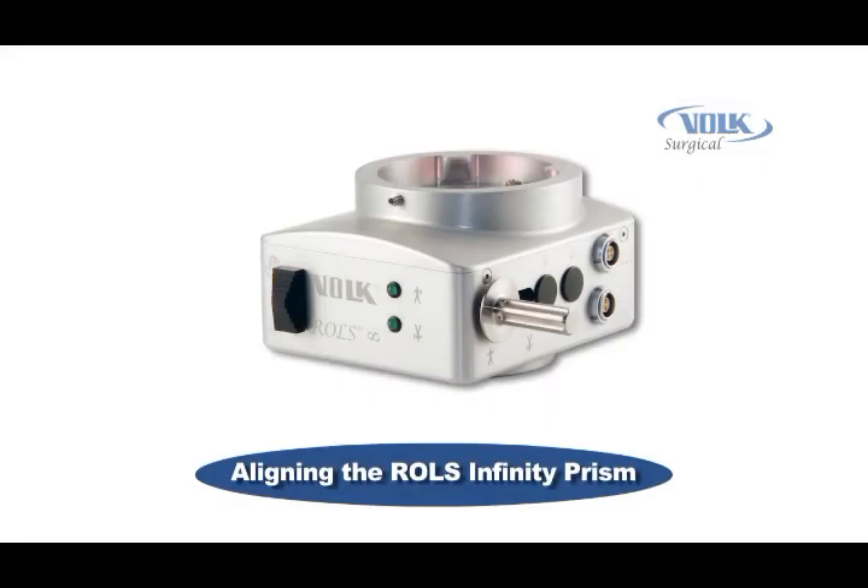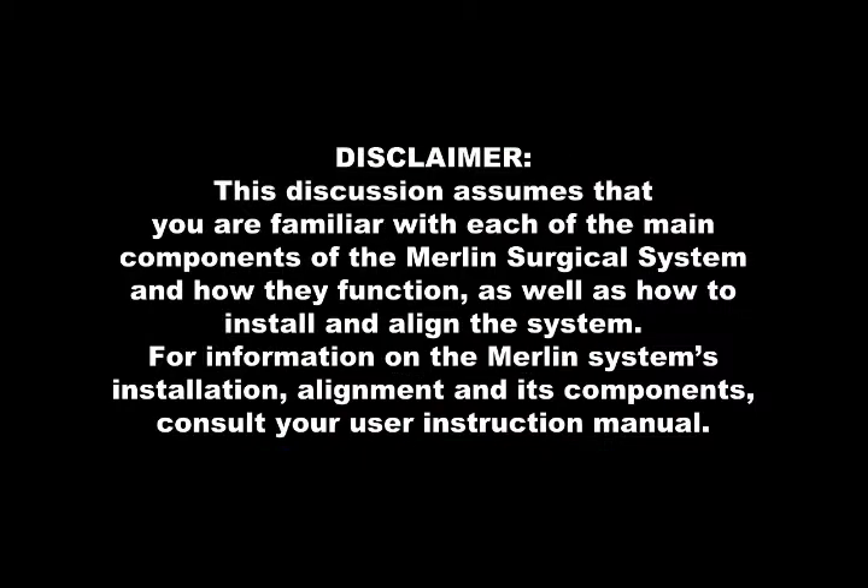Some models of the Rolls Infinity reinverter are designed so that the prism may be adjusted to optically align the reinverter with the microscope. This video section discusses how to align the prism for that model of Rolls Infinity reinverter, and pertains only to those reinverter models that have this adjustment capability. This discussion assumes that you are familiar with each of the main components of the Merlin Surgical System and how they function, as well as how to install and align the system.